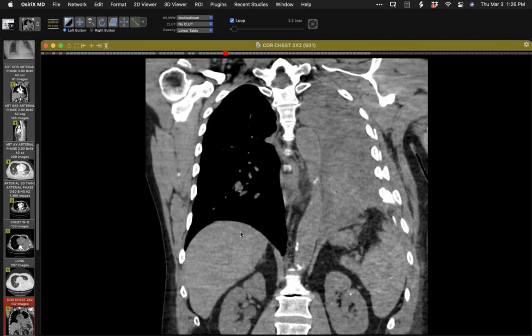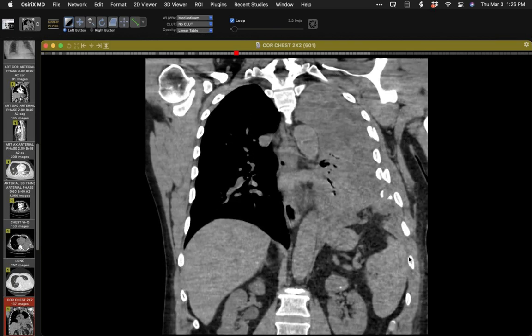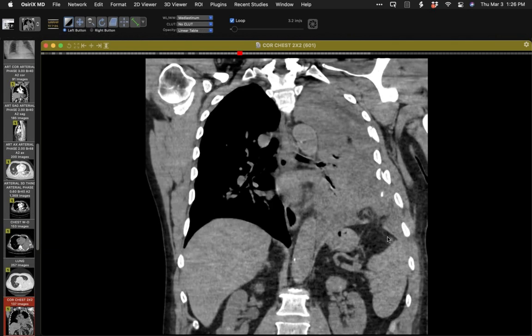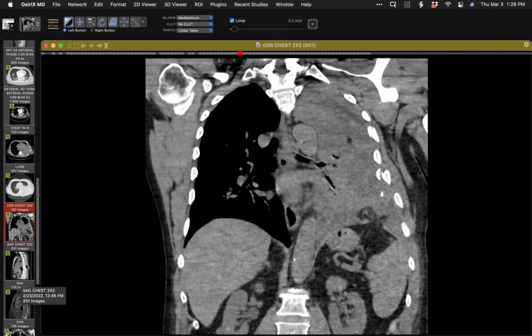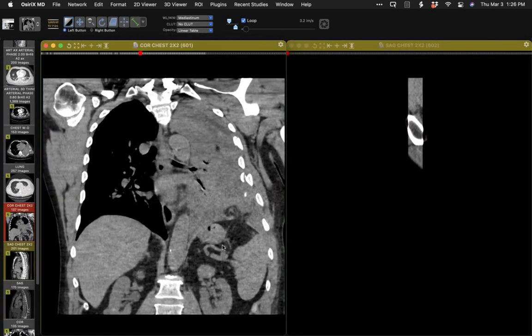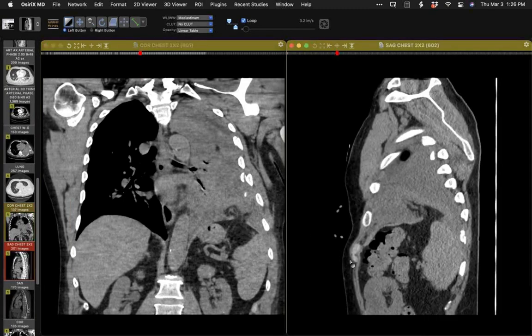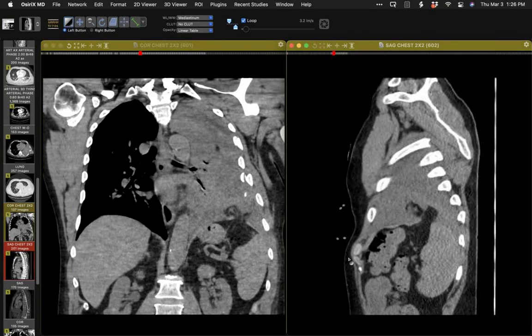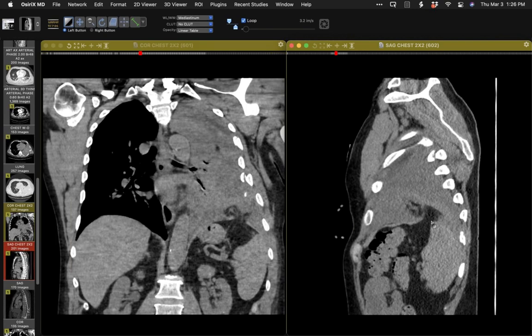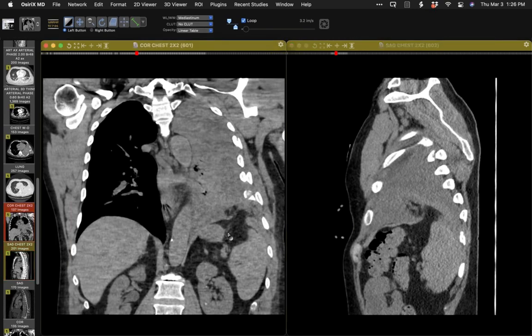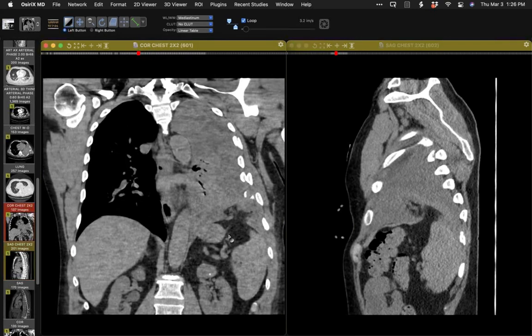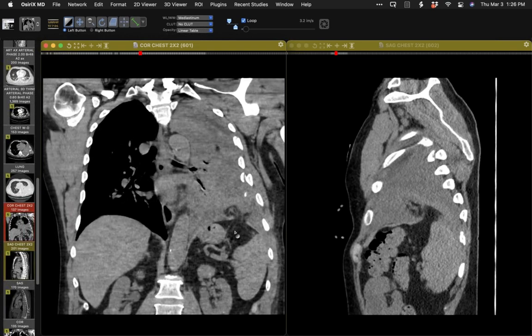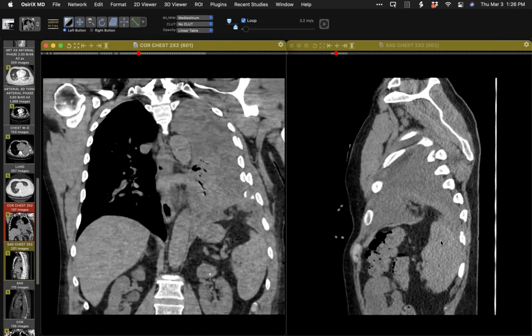On a non-contrast CT with fractures — wait, here. What's this here? This wasn't described in the report of this exam. Pleural fluid here. And on the sagittal — that sure looks like a hemidiaphragm injury and defect, with a little bit of fat herniating through the defect into the basal chest.